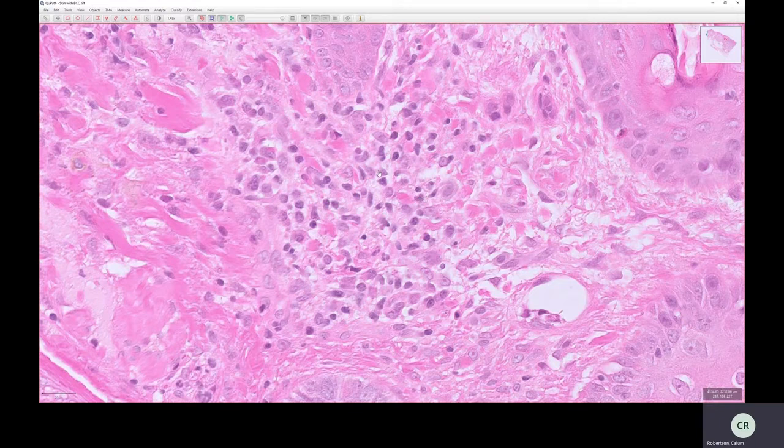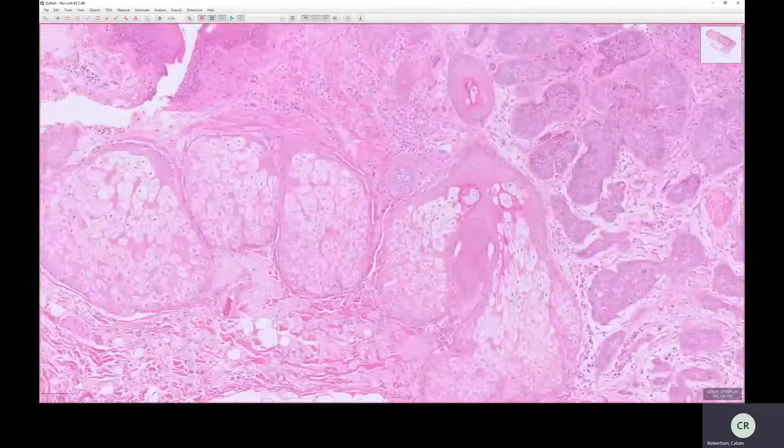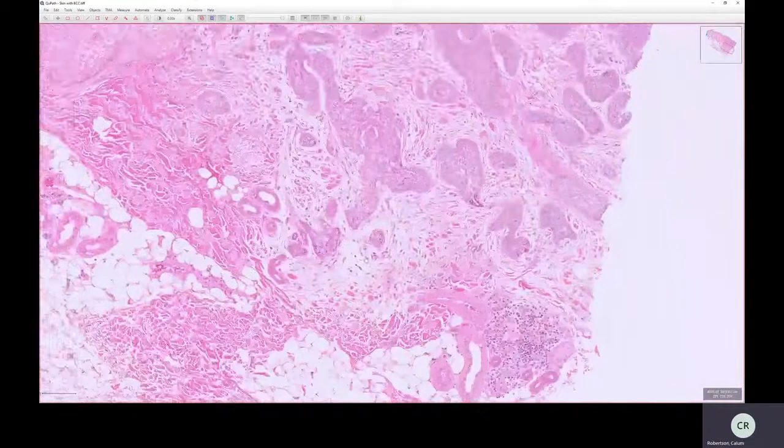There's not really much to say about lymphocytes. They are part of the chronic inflammatory response, and so lots of lymphocytes indicate chronic inflammation. If you see a lot of lymphocytes, that indicates there is an increase in chronic inflammation. So that's lymphocytes. Really, you'll see them on all sorts of tissue sections, and they're one of the easiest things to identify because not much else really looks like a lymphocyte.